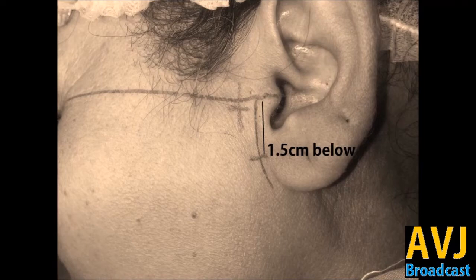Almost 0.5 centimeter deep you have to inject the local anesthesia, and this will block the auriculotemporal nerve.